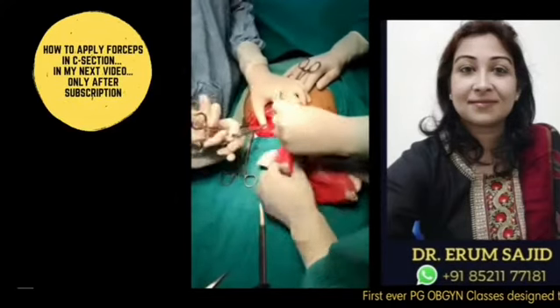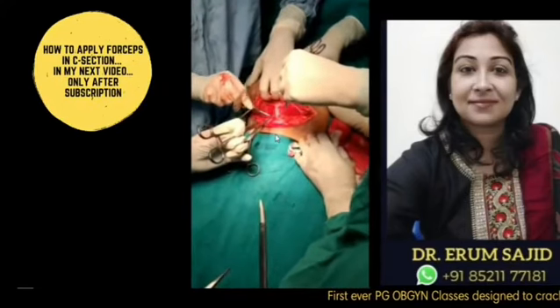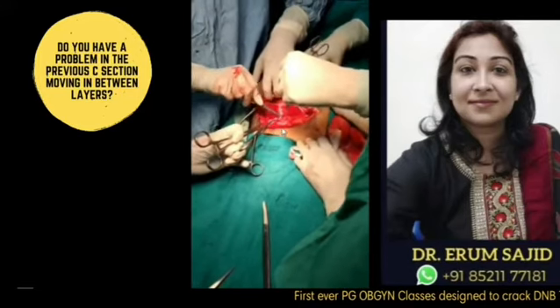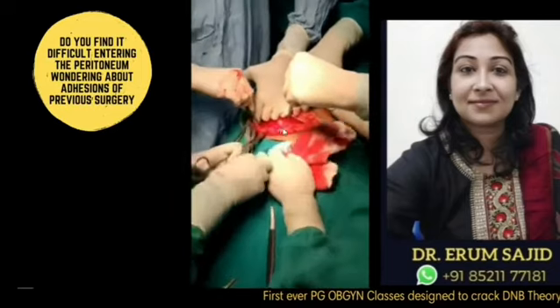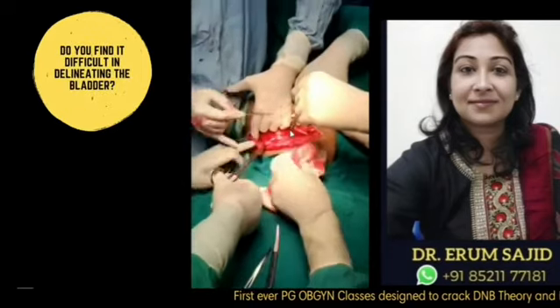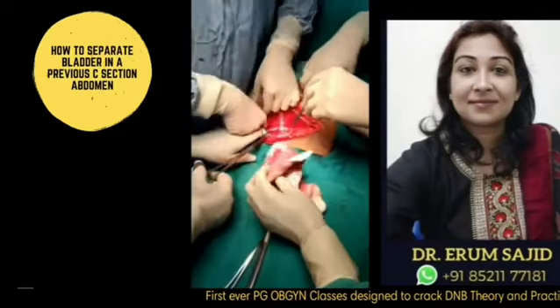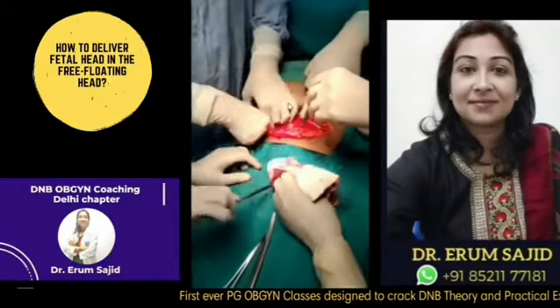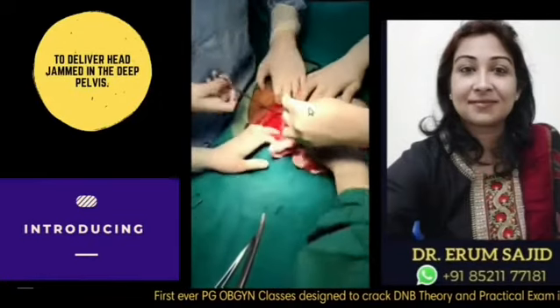Now this is the lower rectus sheath. Again, very gentle, superficial strokes, beautiful strokes which are not deep, just sufficient to make it easy for them to pull. The fascia which is clinging on the rectus sheath, I'm just trying to separate it slowly. And still not happy with the space, so I'm trying to use blunt force, because here I'm finding some space, which I did not find this side.